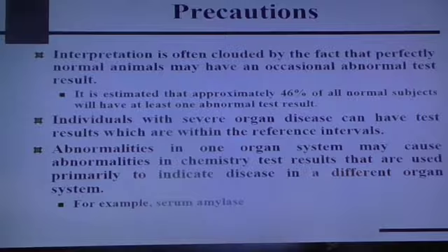What if I have a very high amount of the enzyme? Can it go meet and convert the substrate that quickly? We get one reading, and then we don't get any more readings. That's substrate exhaustion. Anybody familiar with substrate exhaustion? Basically, it means that you've used up your substrate so rapidly that you didn't get but one reading, and it's down here. That doesn't mean you didn't have that enzyme. You had a lot of that enzyme that went very quickly. So those are some of the things that we have to use as far as evaluating these things, okay?